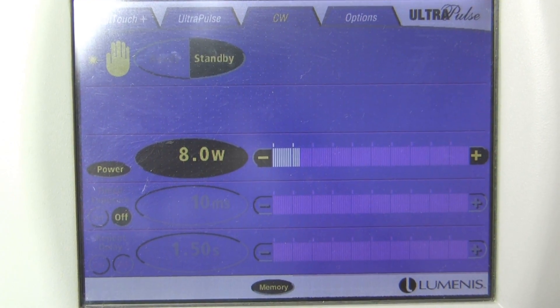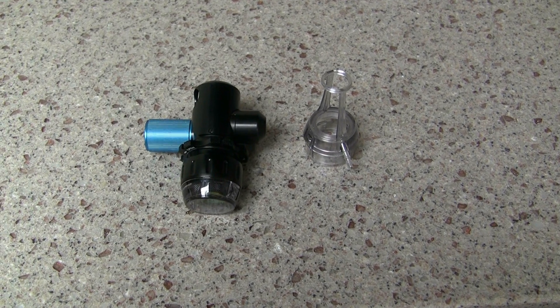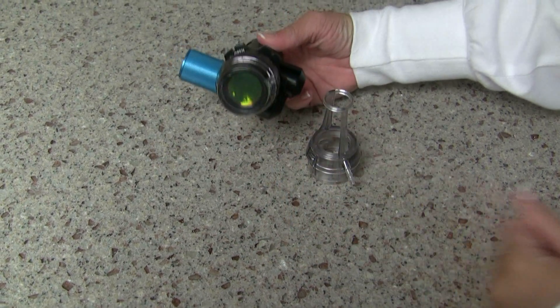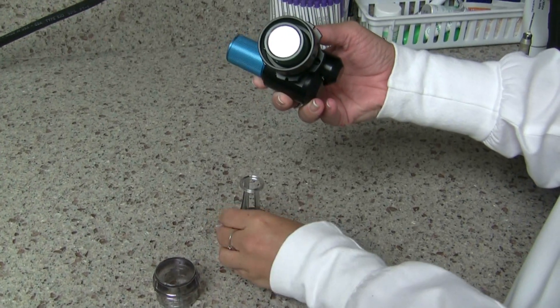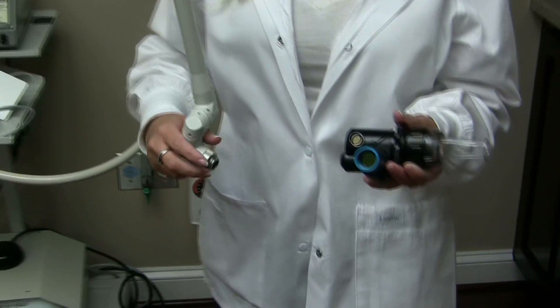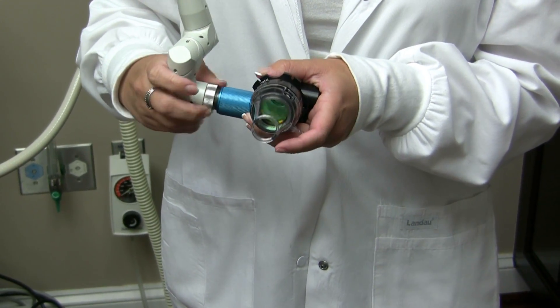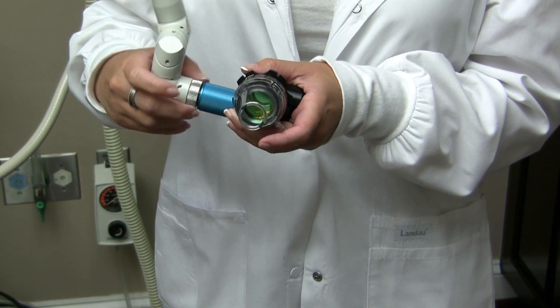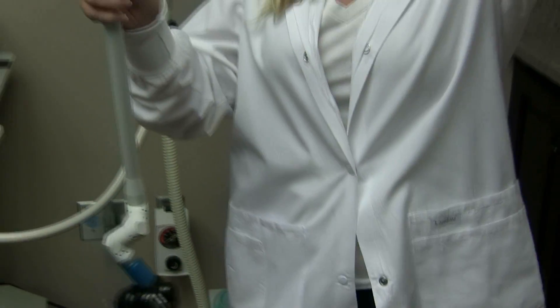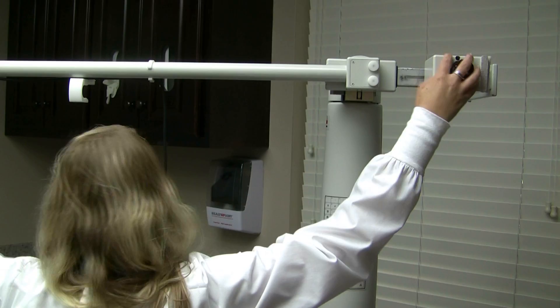The last handpiece is the Deep FX. On the handpiece itself there is a plastic cover to protect the lens from scratches. Pull it off — there are two little clips on the edges. There is also an adapter/spacer that helps protect the lens while in use. Just like before, take the silver and connect it to the blue, then screw it on really tight — if it is not tight it will not work properly or register to the laser. It is a little heavy, so balance the weight and tighten it securely.